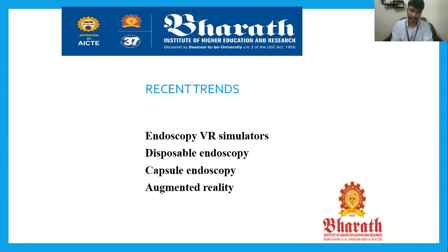And disposable endoscopy means once an endoscopy tube has captured the data, it is not reused. Nowadays every material comes under the disposable category. Once the endoscope captures the image or surgery is done, it is considered medical waste. It will be removed and another endoscope tube will be connected to the channel for the next patient's recording. So disposable endoscopy is also a recent advancement in biomedical application.